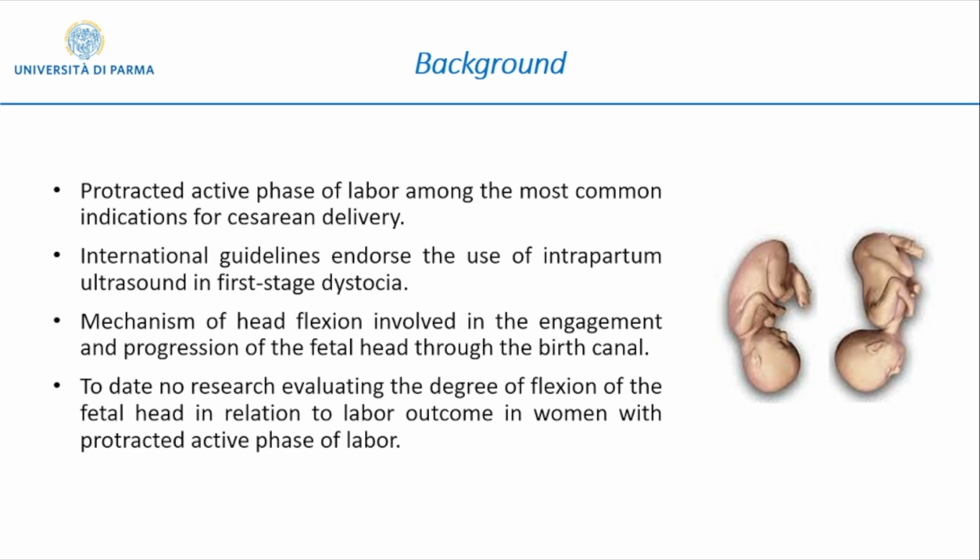Protracted active phase of labor is among the most common indications for cesarean delivery, and according to the international guidelines on ultrasound in labor, intrapartum ultrasound is recommended in conditions of first-stage dystocia.